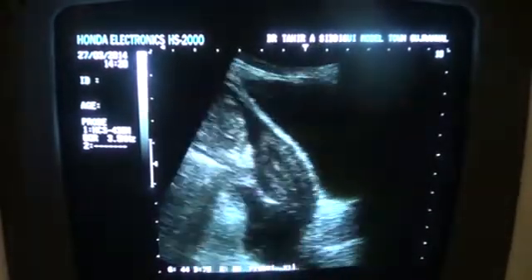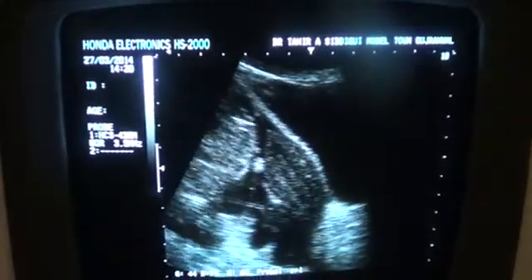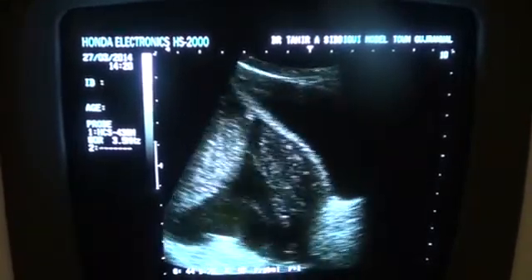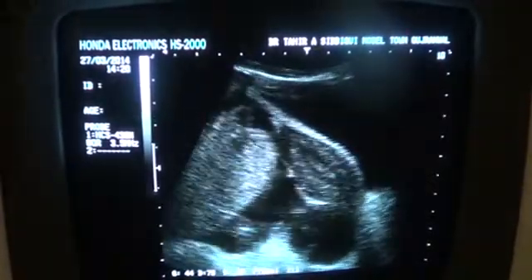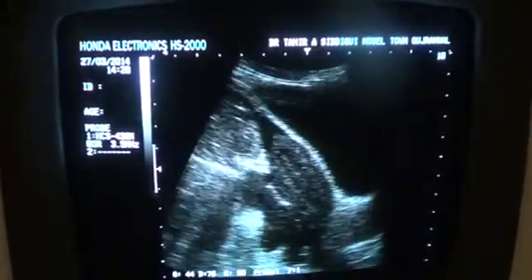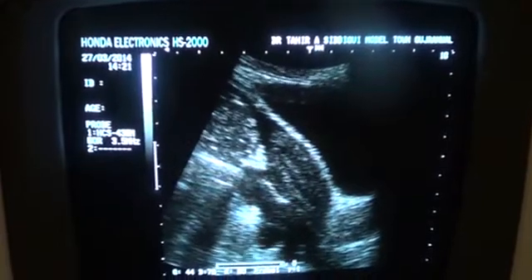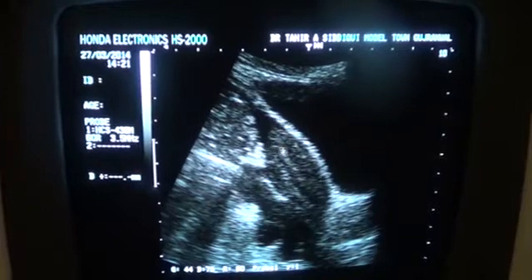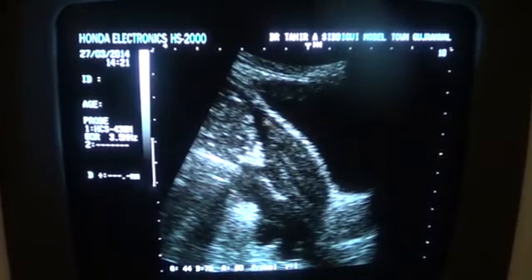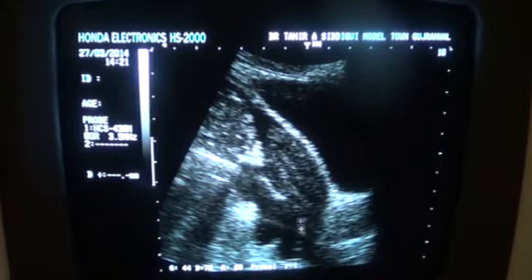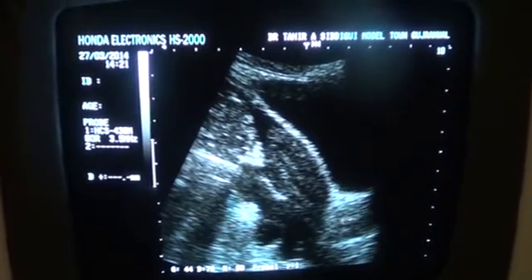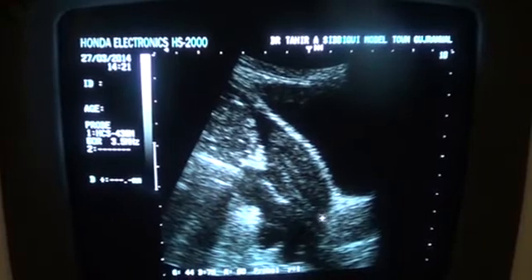In longitudinal section, this is the uterus, the myometrium, and this is the endometrial canal. This is fluid — all of this is fluid. These are bubbles floating in it. This is the cervix.